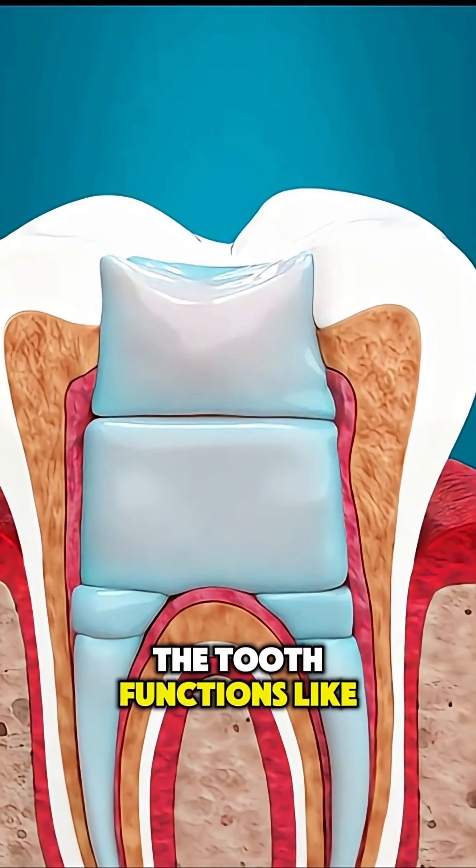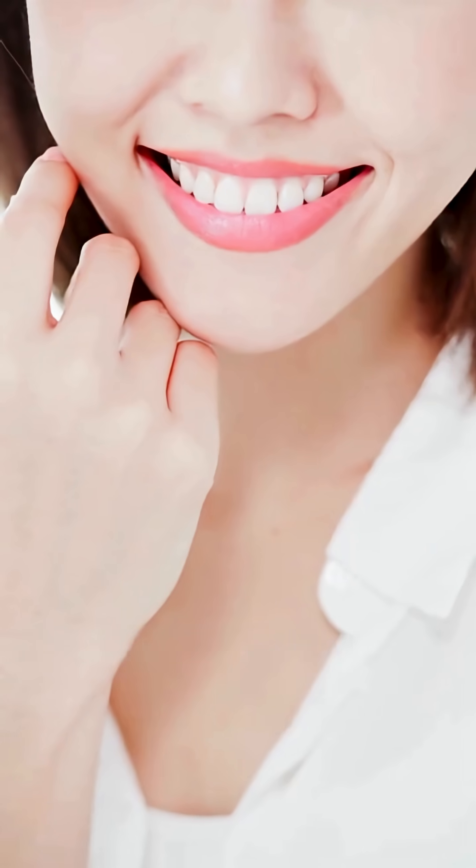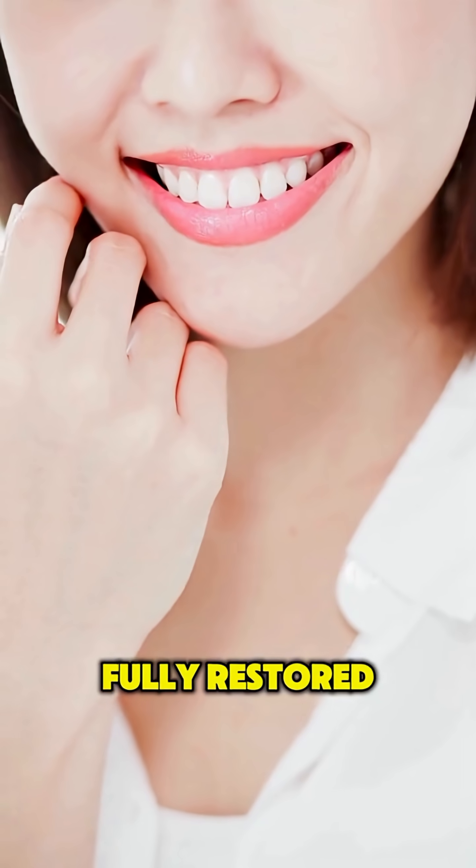With proper care, a tooth that's had a root canal can last a lifetime — strong, pain-free, and fully restored.